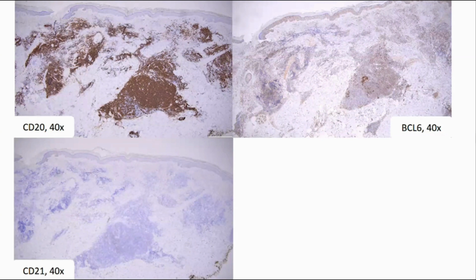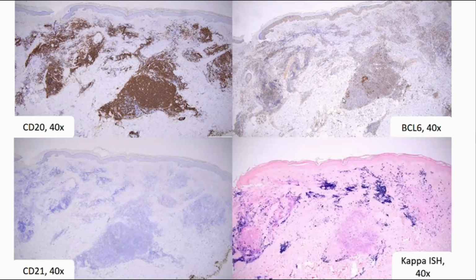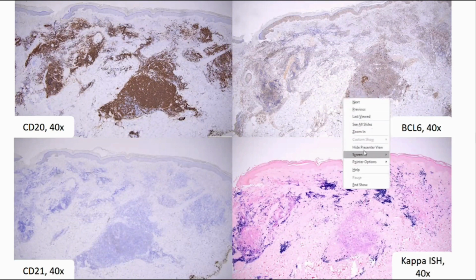But otherwise, there seems to be, if my slides will pull up, kappa restriction here. And maybe if I end this pointer, I think that's my problem here.